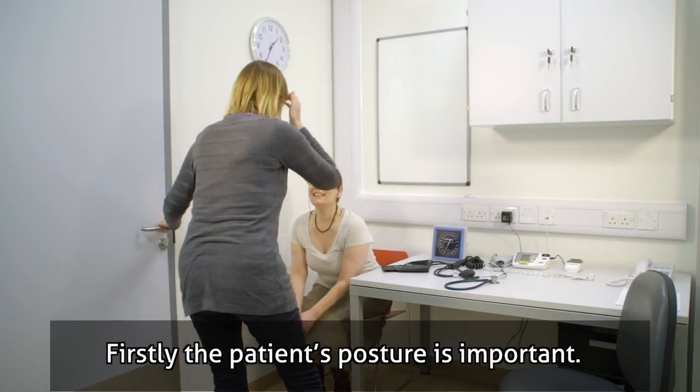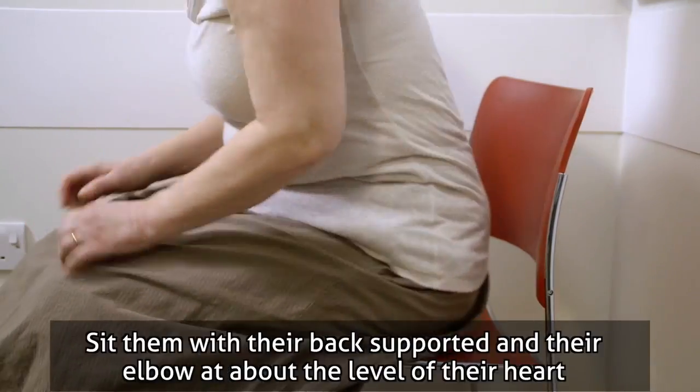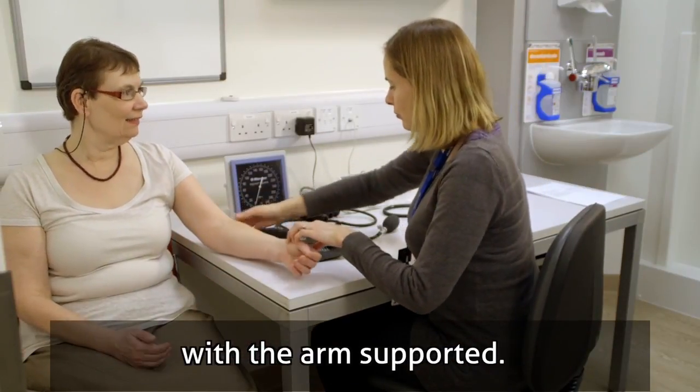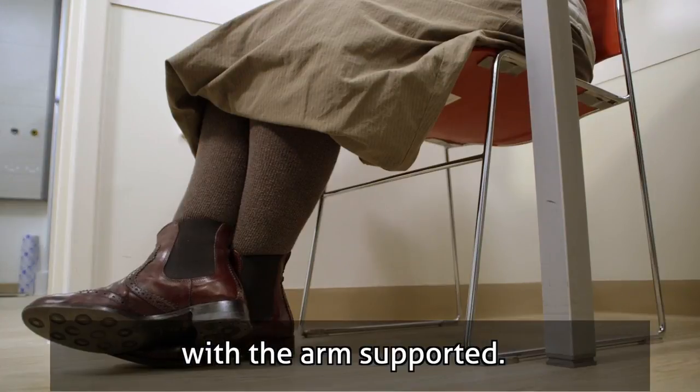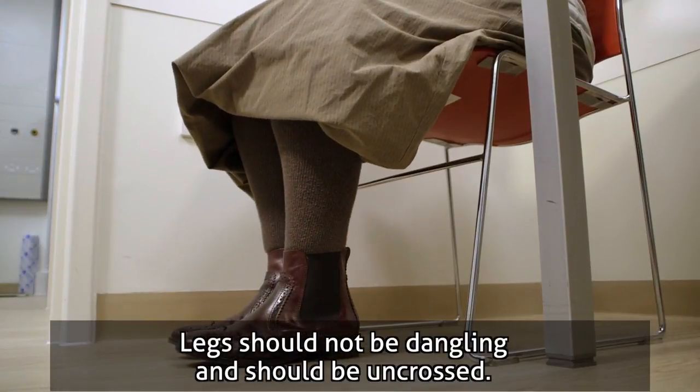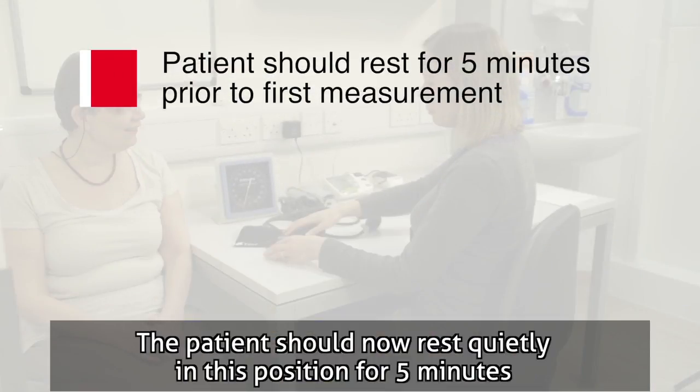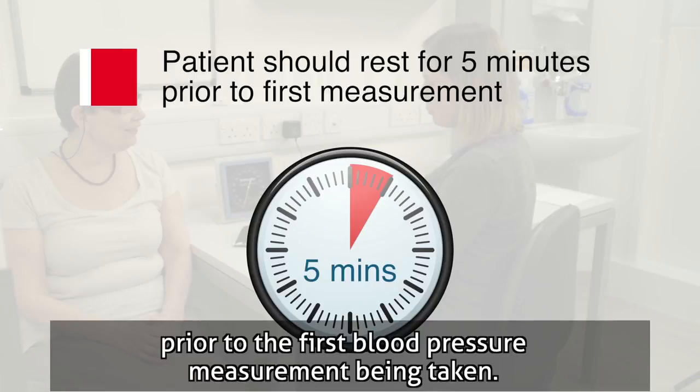Firstly, the patient's posture is important. Sit them with their back supported and their elbow at about the level of their heart, with the arm supported. Legs should not be dangling and should be uncrossed. The patient should now rest quietly in this position for five minutes prior to the first blood pressure measurement being taken.